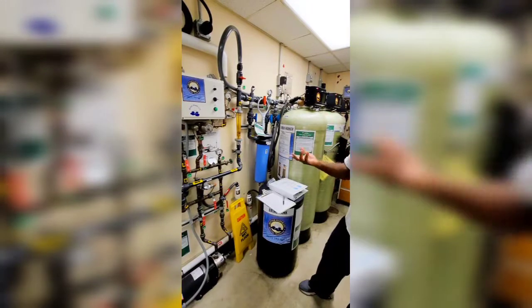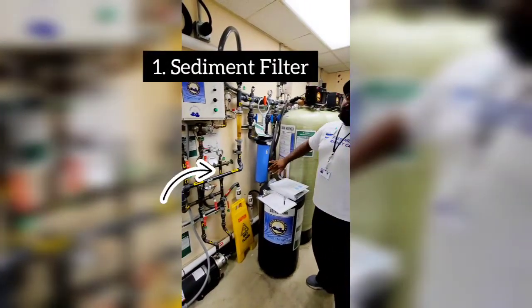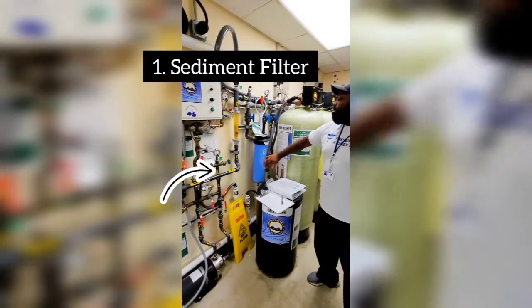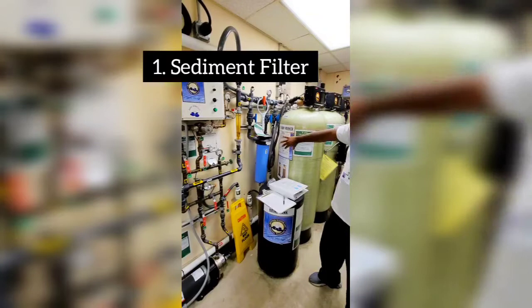The other ones are probably still white right now — they should be fine. But this one will be pretty brown or whatnot. Go through this sediment filter and then go to your first carbon tank, which is a worker carbon tank.